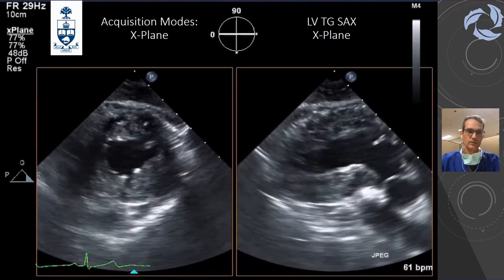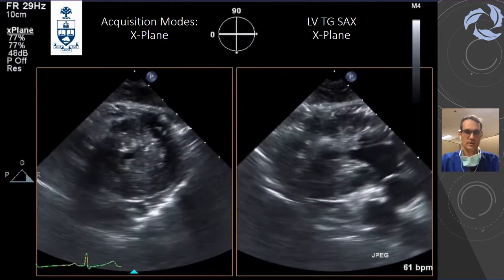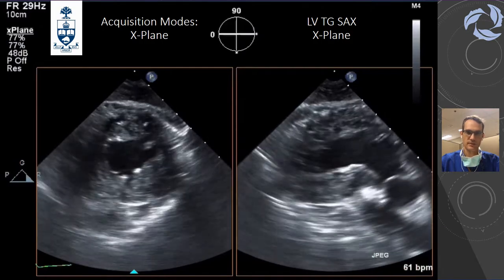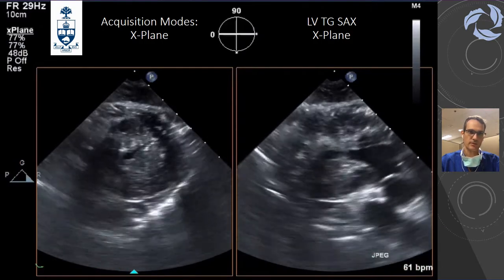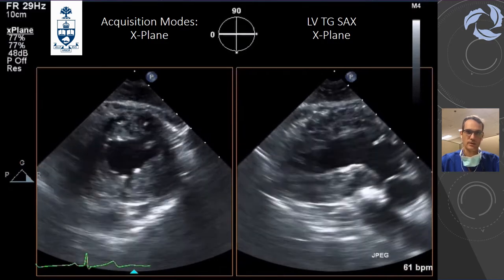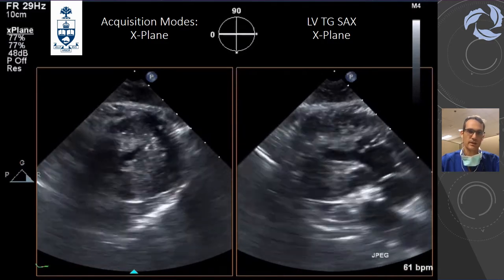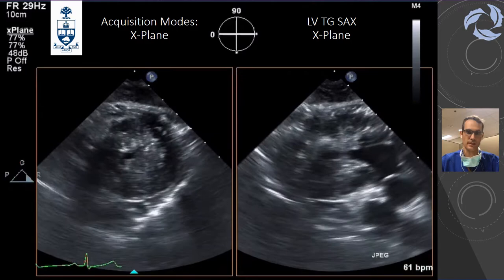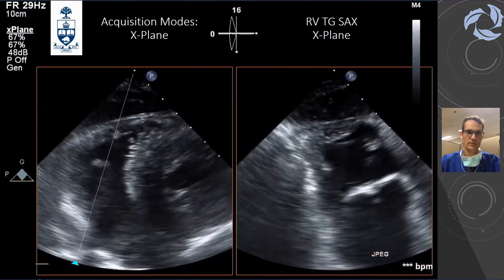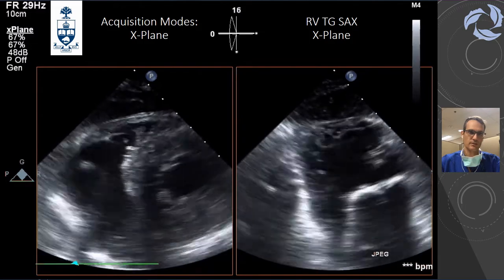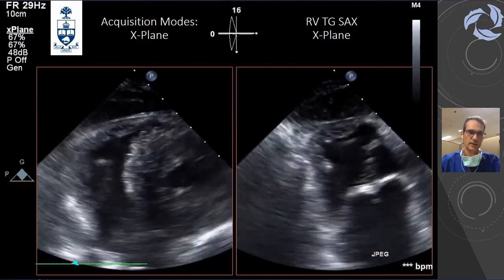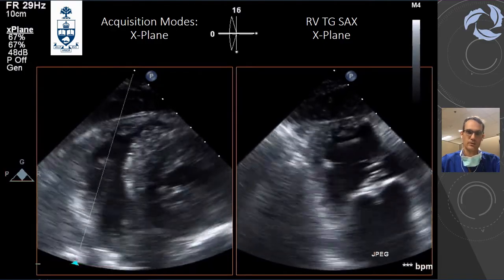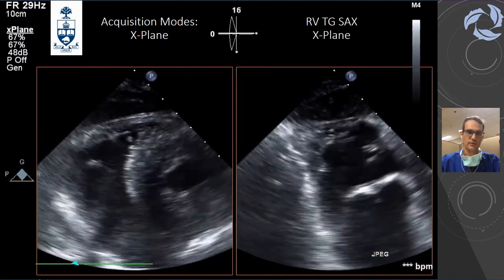Those are examples of the X-Plane acquisition modes. From the trans-gastric short axis view of the LV, we automatically get a 90-degree view, making it easy to assess all walls in both views. Same thing from the 4-chamber view — you get the 2-chamber view and can do a Simpson's biplane to estimate ejection fraction. Another example of when to use X-Plane is for the right ventricle: from the trans-gastric RV plane, you cut it, get 90 degrees, see the tricuspid moving towards the septum, and assess RV function.